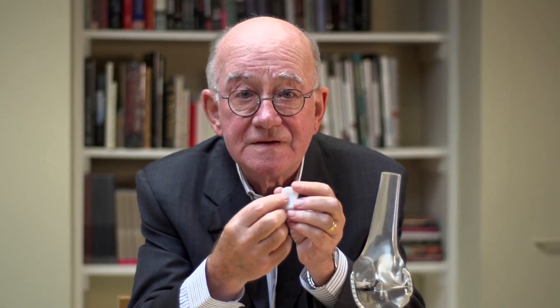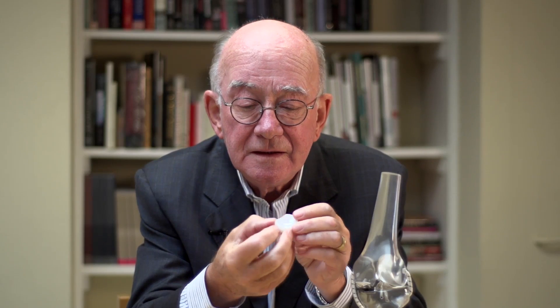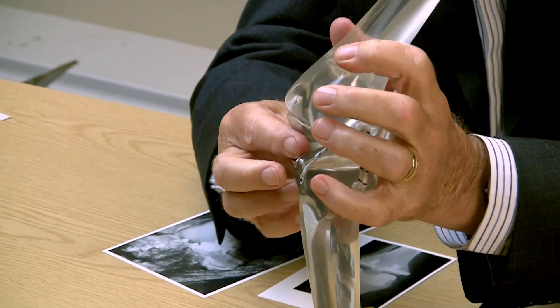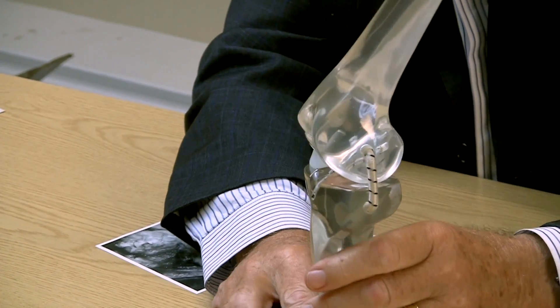The upper surface of this bearing is a spherical socket, which fits exactly the shape of the surface of the component which is attached to the femur. And the lower surface is flat, which exactly fits the flat surface of the component attached to the tibia. And when the surgeon snaps the bearing into place, then we have a prosthesis.